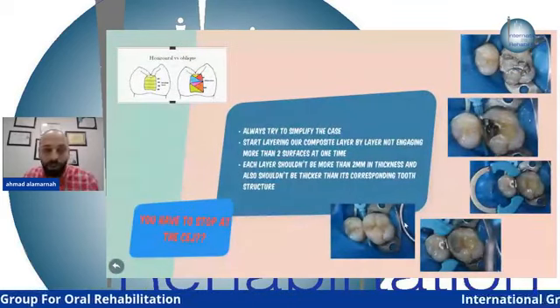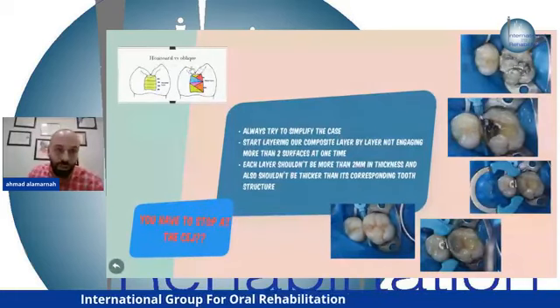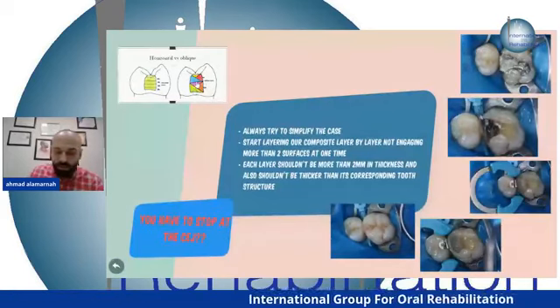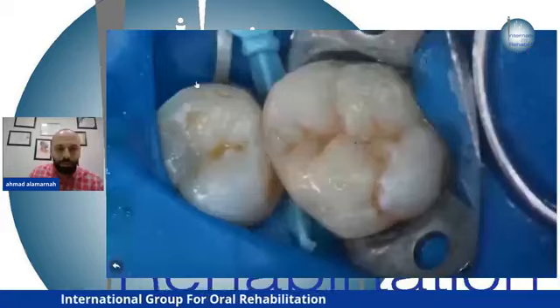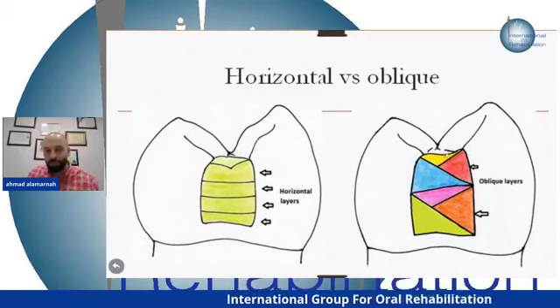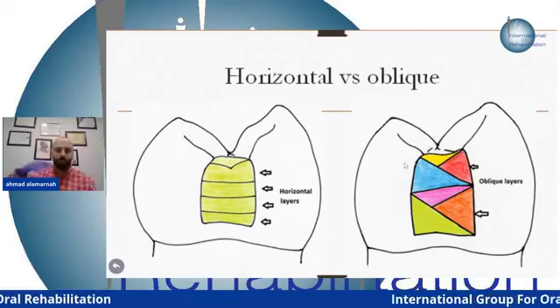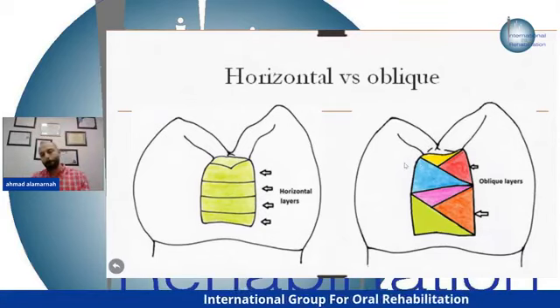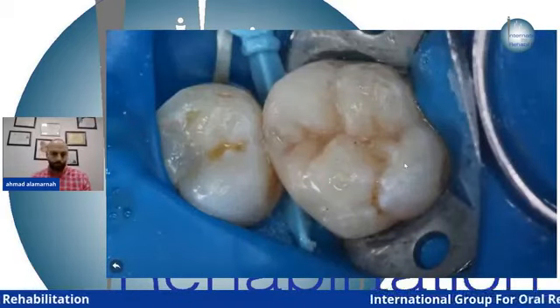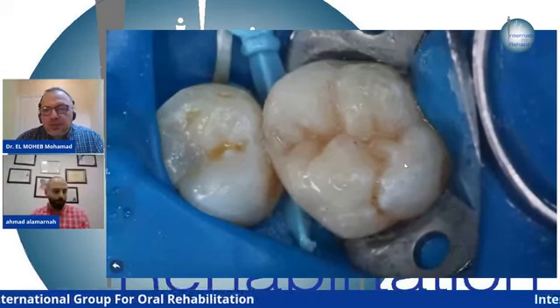But we have to stop here. Let's say we have to stop at the cemento-enamel junction. Anybody knows why? You can build the layers here, here, here, here, but you have to stop at the cemento-enamel junction, or you have to stop when you engage enamel. Why? And you have to treat the composite in a different way. Why? Any answers?